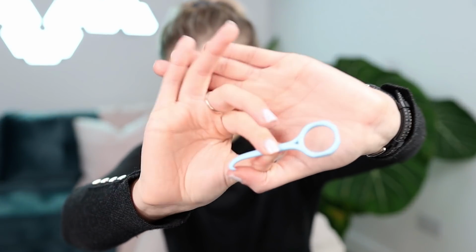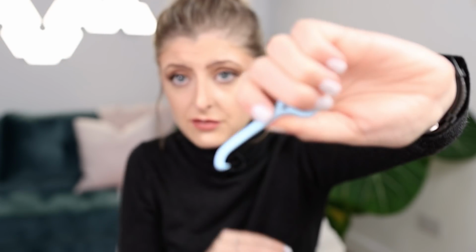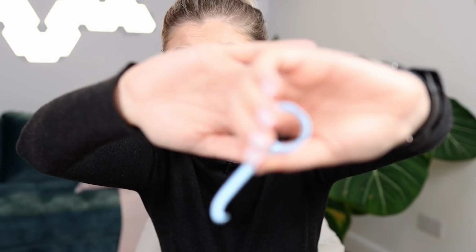Because honestly, for me, when I had that, I still have it, the little pocket where it's been getting irritated at the back, the last thing you want to do is put your finger in there if you've got a long nail to get that out. It'll just be very uncomfortable. So I honestly recommend these. And again, I just don't see anybody talking about these at all. I really don't.